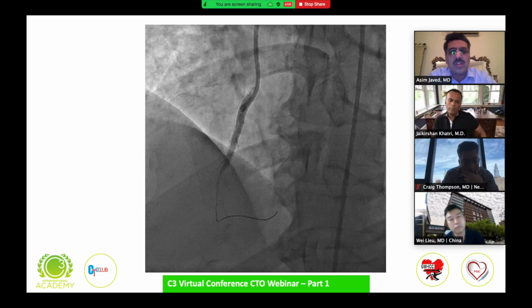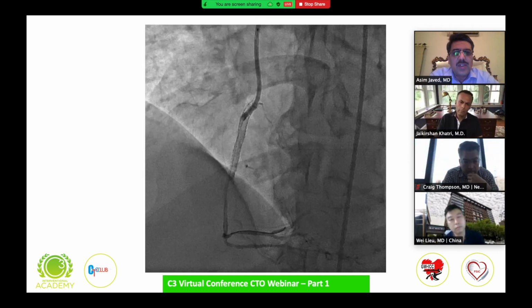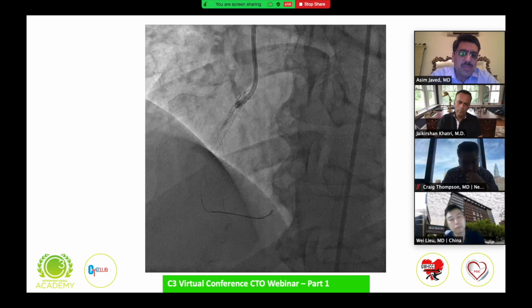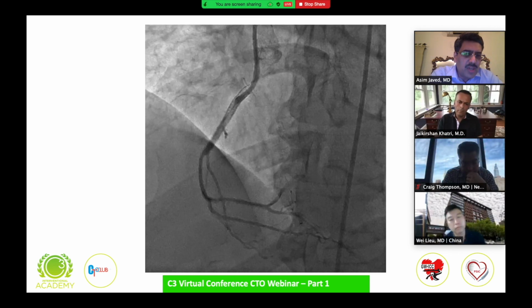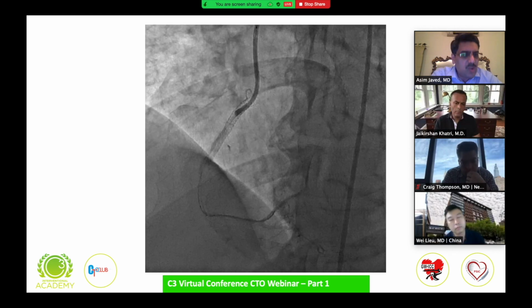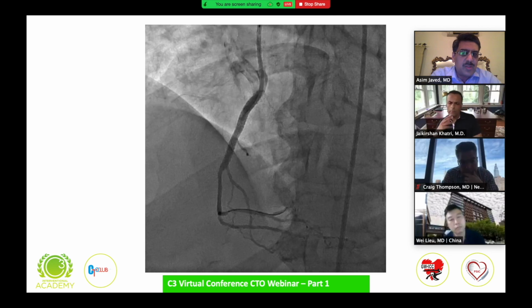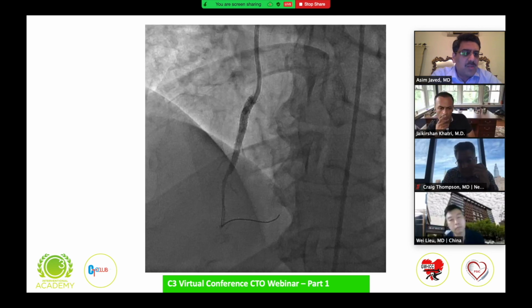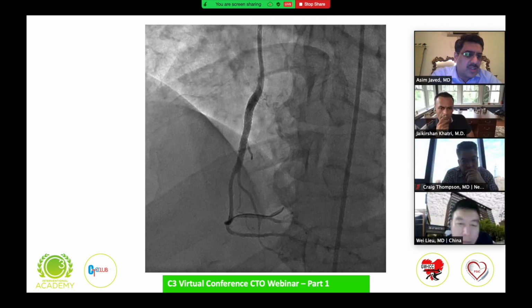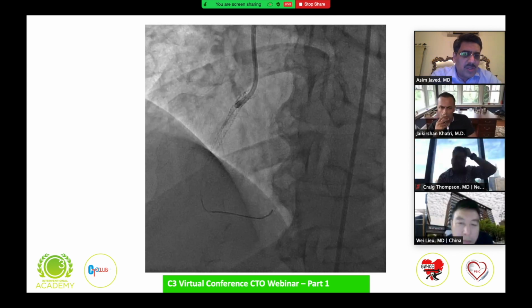And this is then the final result, and now the catheter could easily sit in, and so it was a simple CTO approach coming retrogradely, but it was an interesting learning point that this can also happen, that at the end of the procedure the wire exited from the side struts rather than going through the middle of the stent. Thank you very much.